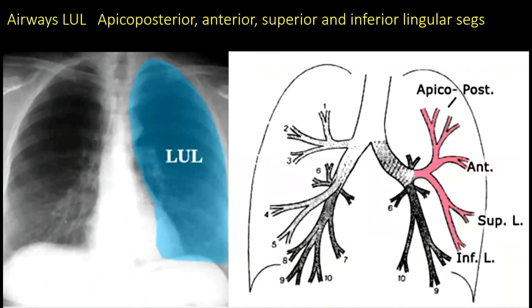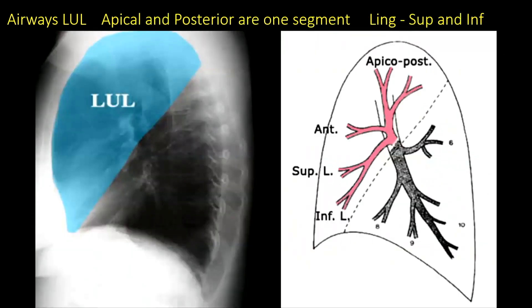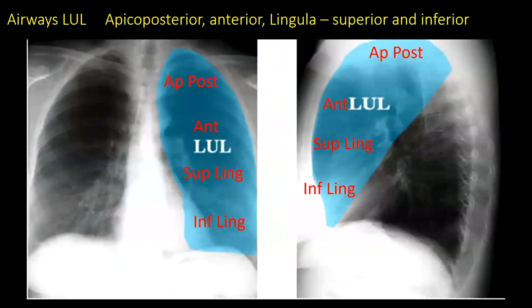The left upper lobe is different. The apical posterior bronchus is one segment instead of being a separate apical and posterior. Then there's the anterior, superior, and inferior lingular segments. On the lateral view, you can see the apical posterior, the anterior touching the back of the sternum, then the superior lingular and then the inferior lingular segment. They're fairly well differentiated on either the PA or the lateral film. The superior lingular touches the upper left heart border and the inferior lingular touches the lower left heart border.